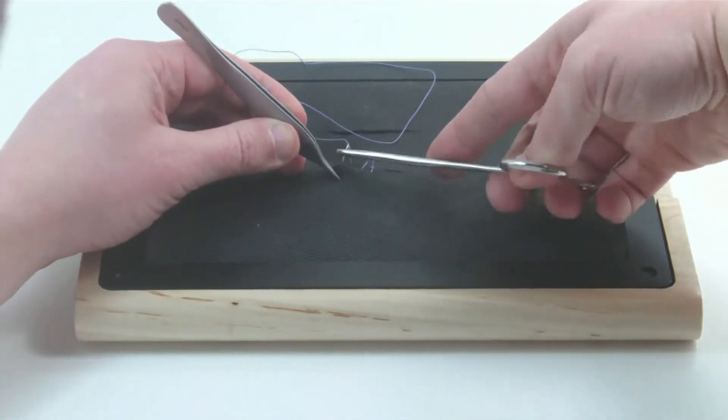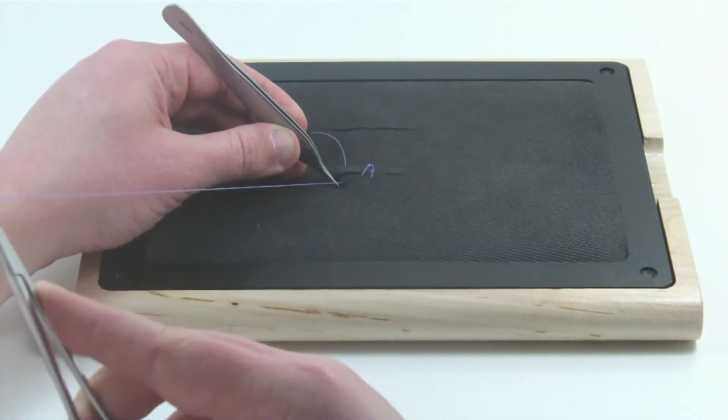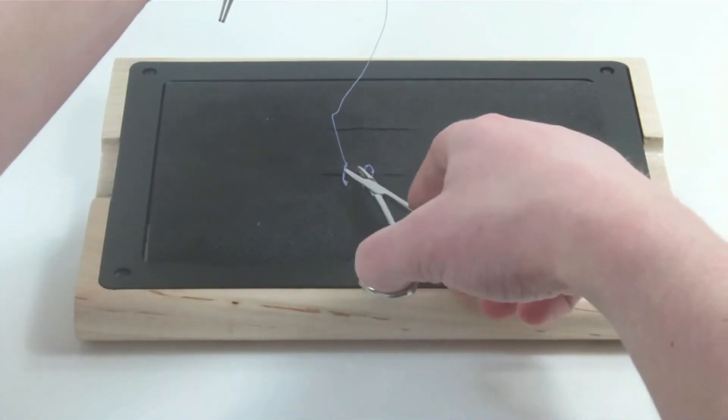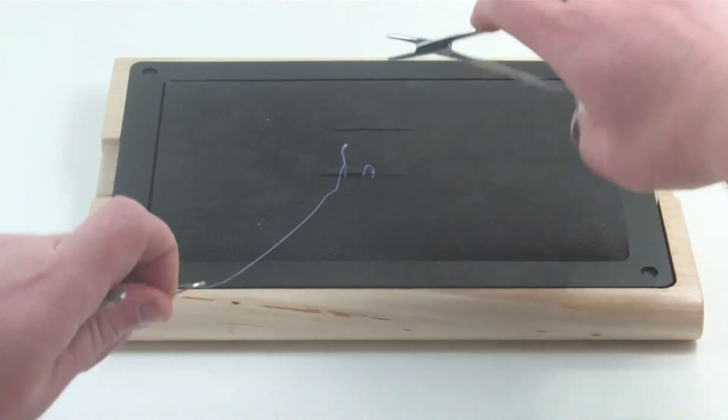Any type of stitch, including simple interrupted, running, horizontal or vertical mattress, and even subcuticular stitches can be applied.